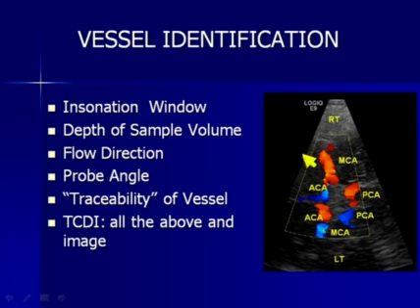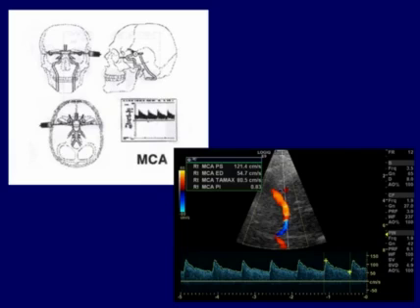And we'll go by the depth of the vessel, what direction the flow is appearing on color, if we can trace back or track back that vessel, and we're going to use that all with both modalities as well as the image when we're using transcranial imaging.